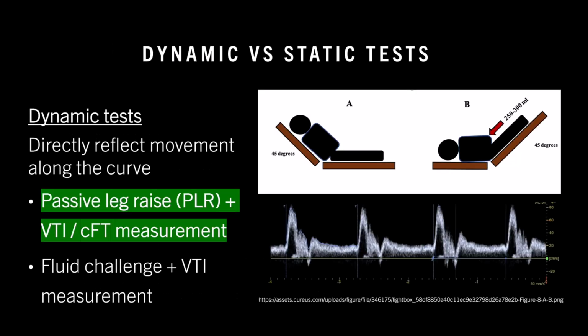So static tests will tell you what preload looks like, whereas a dynamic test tells us what happens when preload changes and how we can directly assess movement along that curve. What we mean by dynamic is that we're adding in a challenge, such as a passive leg raise or a fluid bolus, and measuring the real-time physiologic response using ultrasound to determine a patient's volume status. Today, we'll be focusing on a passive leg raise as our physiologic challenge.